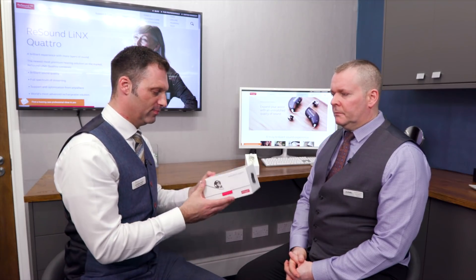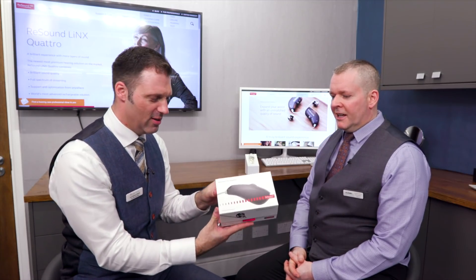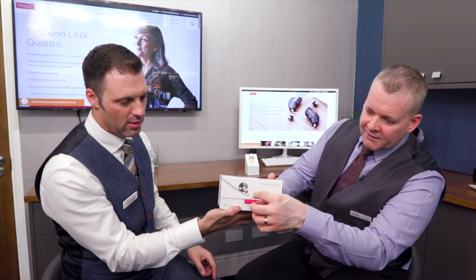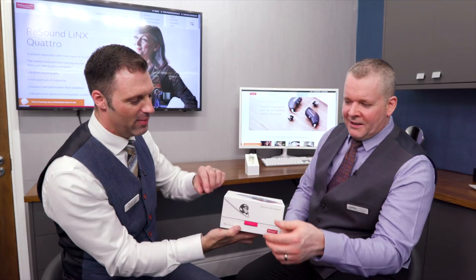Today we're going to be reviewing the ReSound Quattro Nines. Now, this is lovely - it really is. This is the best packaging, hands down, from any manufacturer. Do the flappy thing - listen to this. This is nice. How nice is that? We like that.